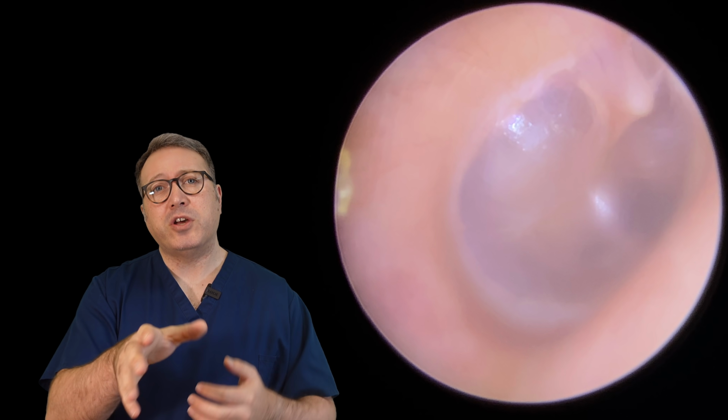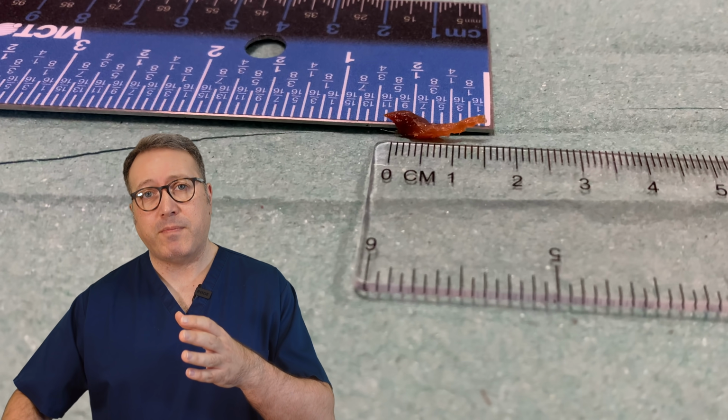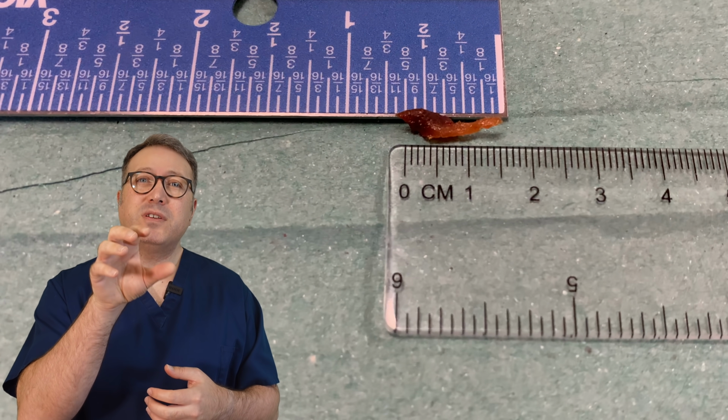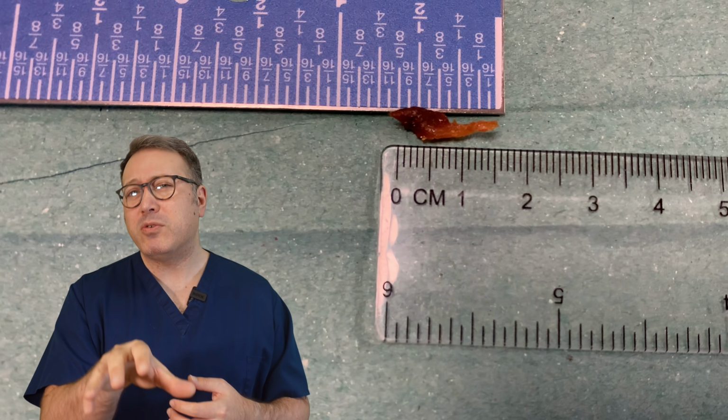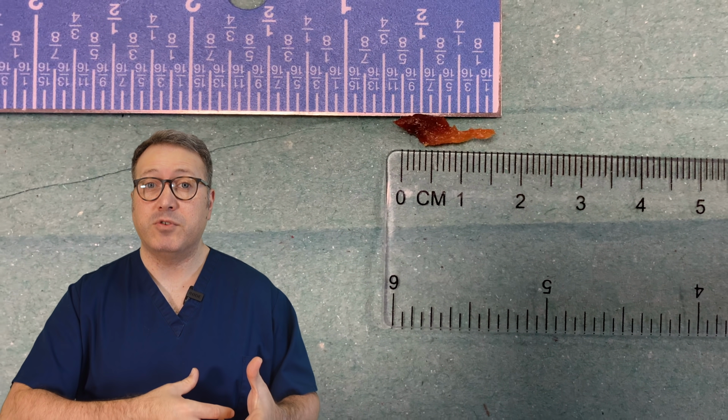So eardrum looking good. It's a right side of the eardrum because it's pointing off to the right side, and you've got the hammer bone pointing off to the right and the light reflex on the right side there. So you can see this plug that we removed. It's a centimetre and a half, three-quarters of an inch there. The skin pieces that we took away all got sucked inside the machine there.